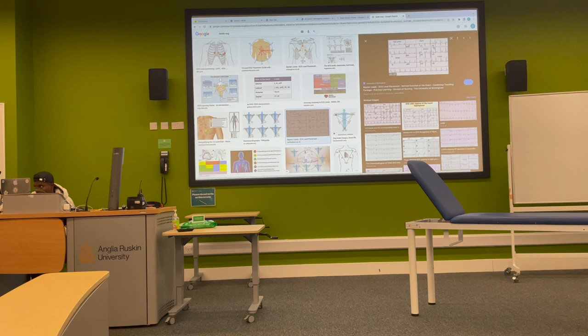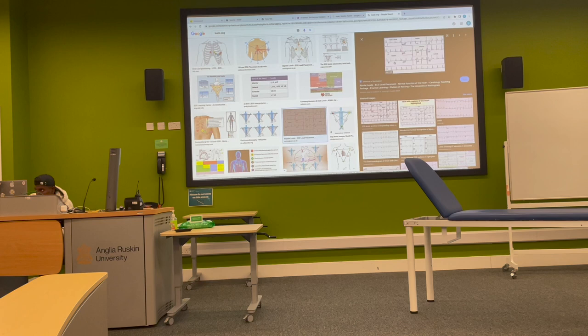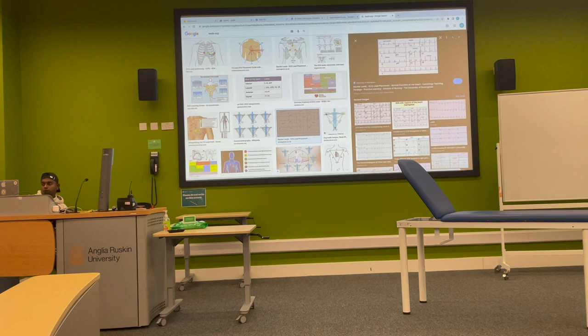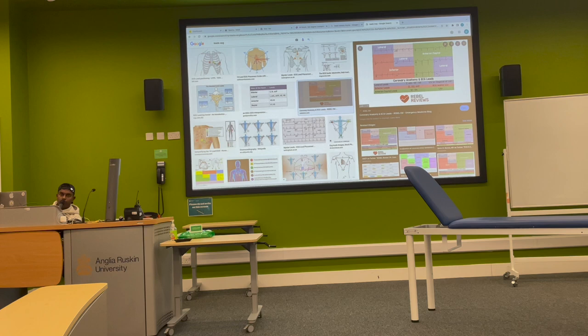So these two are anteroseptal, so that's technically septal. V1 and V2 are septal, then V3, V4 are anterior, then V5 and V6 are lateral. So you've got L-I-I, S-S-A-A-L-L, or S-A-A-A-L-L, because anteroseptal, there's a bit of overlap, but yeah. Do you get me? Do you understand? Yeah, I just need to memorize it. So that's Lily: S, S, A, A, L, L. Lily Sal.